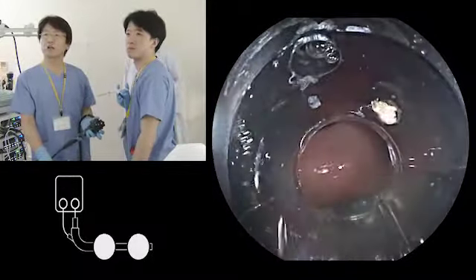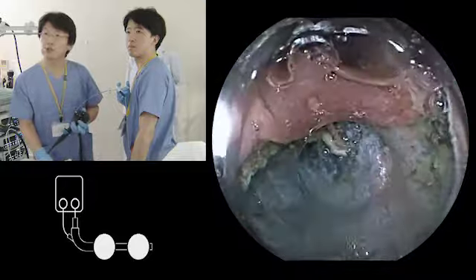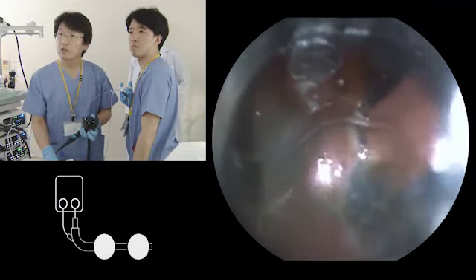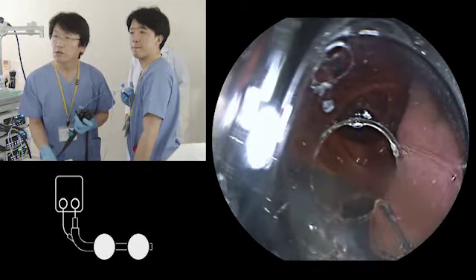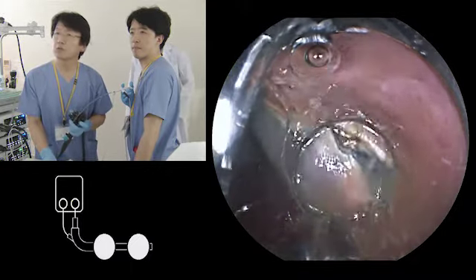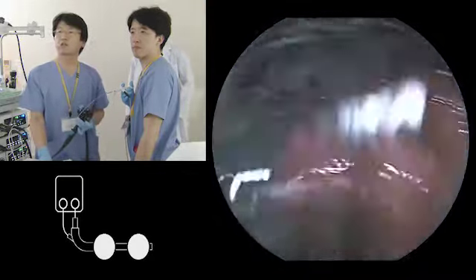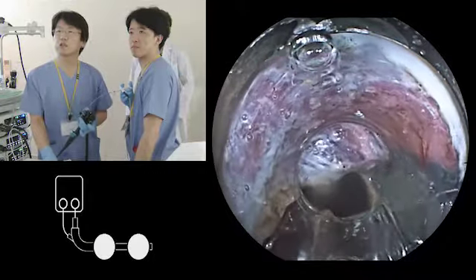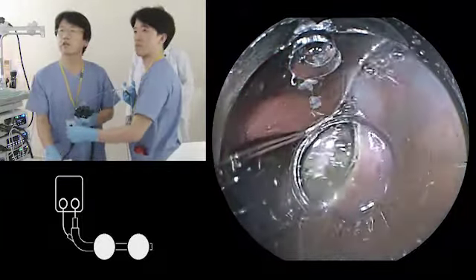Okay, I will show you what I have done so far. As I had shown you, I dissected the submucosa first, and I opened from the lower side in terms of gravity. This is the lower side, and I opened the pocket, and went to the backside of the lesion as well, and went up to here. So now, what's the result? The result is like this. The lesion is already dissected, and only this side remains. So I will dissect this side.